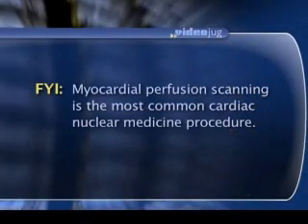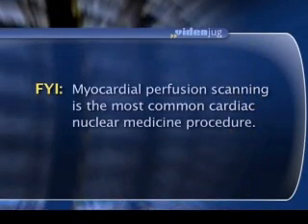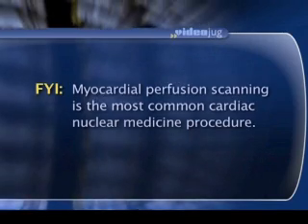Myocardial perfusion scanning is basically a nuclear medicine technique where we inject the patient intravenously with an appropriate tracer designed for looking at perfusion or blood flow to the cardiac muscle. For example, we can give technetium-99m sestamibi or tetrofosmin or thallium-201 chloride, which basically go through the coronary arteries into the heart muscle and tell us how the muscle is being perfused. That's what's called cardiac perfusion imaging.